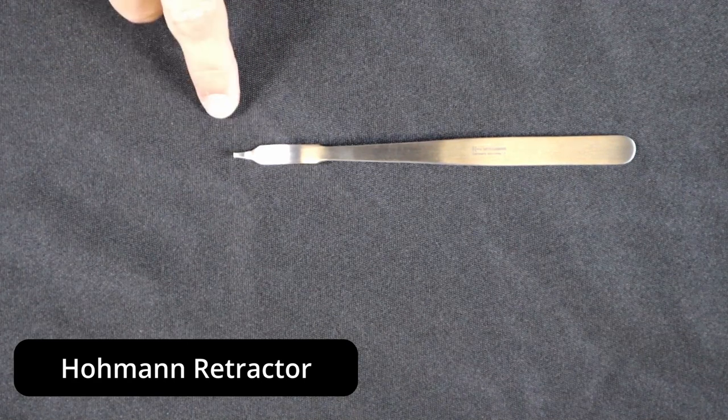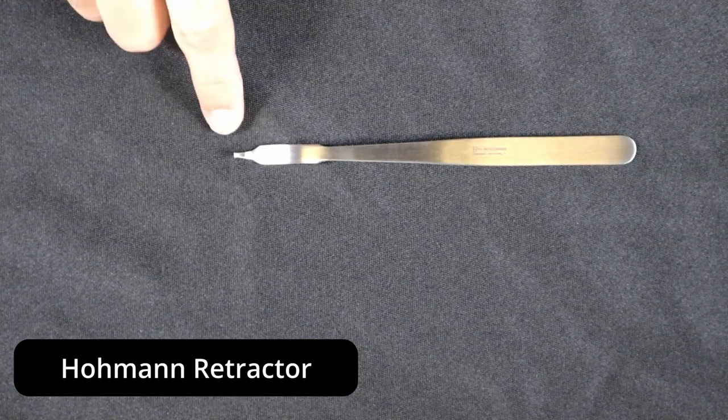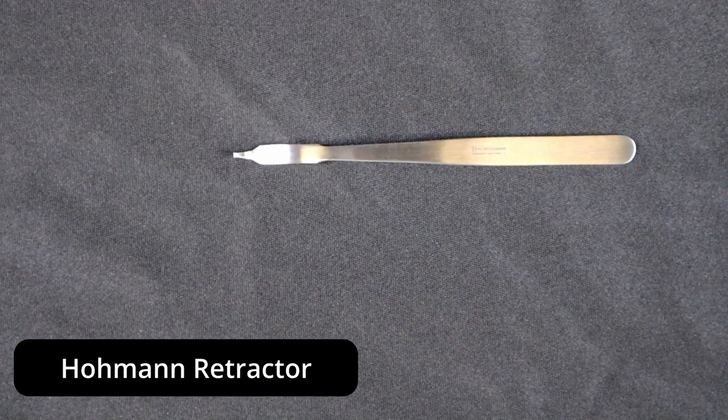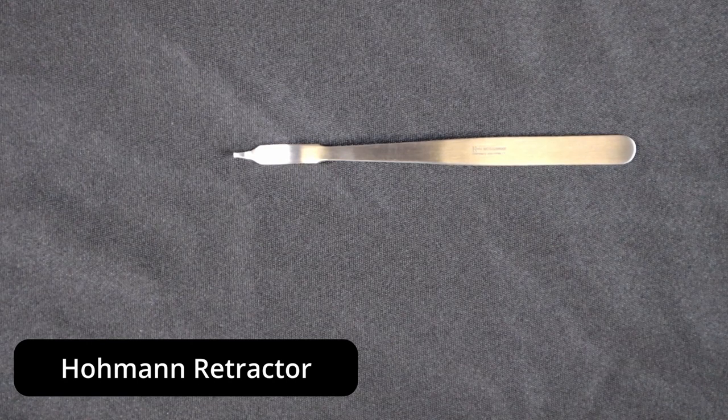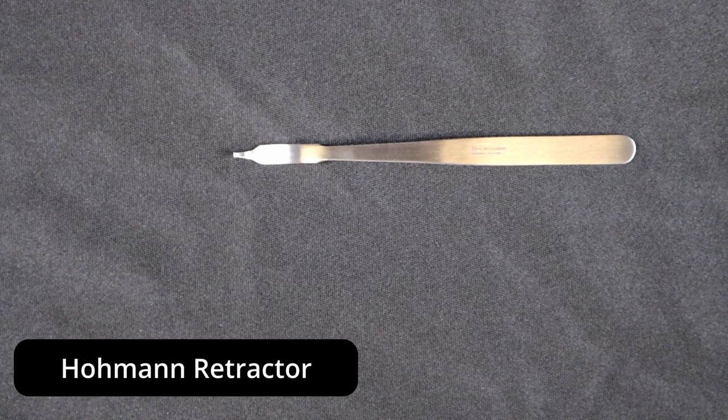So there are some folks out there that will put a tip protector, for instance, on the tip of their Hohmann retractors, especially for these smaller Hohmanns that are easier to damage than your full-size ones.